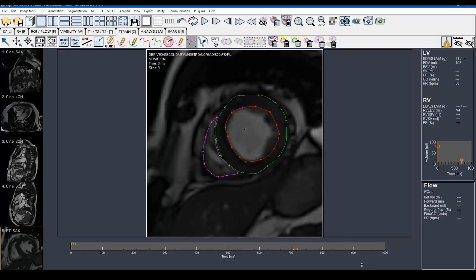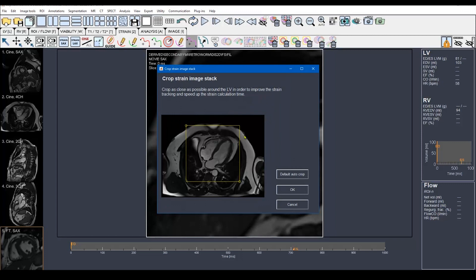Drawing the RV endocontour at the basal slice, then for the mid ventricle, and for the apex. Now we have finished drawing the endocontours and epicontours for the LV and RV in the short axis view. If you want to calculate only the circumferential and radial strain you are now ready to move to the next step. But if you want to calculate the longitudinal strain as well, you have to draw the endo and epicontours in the three long axes. The registration is just done, so I will move to calculate the longitudinal strain — from Strain and then Start Feature Tracking Long Axis Analysis.